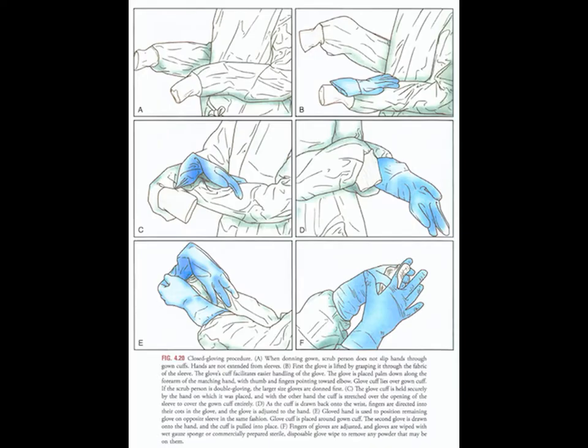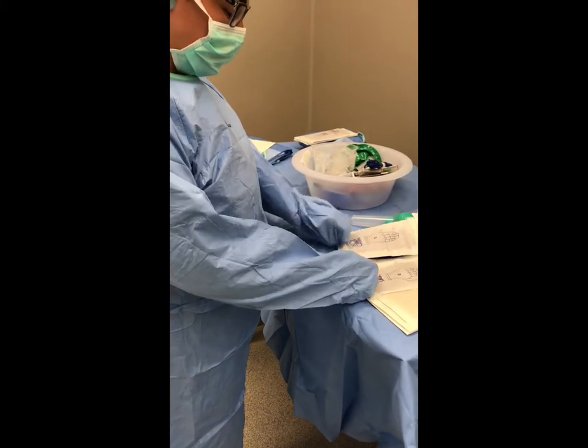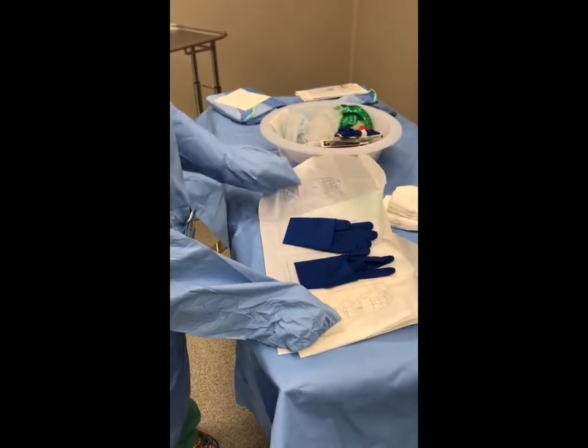The closed gloving procedure should be used when initially donning a sterile gown and gloves. The glove is placed palm down along the forearm of the matching hand, with the thumb and fingers pointing towards the elbow. The glove cuff is held securely by the hand on which it was placed, and with the other hand the cuff is stretched over the opening of the sleeve to cover the gown cuff entirely. As the cuff is drawn back onto the wrist, fingers are directed into the glove and the glove slides over the hand. The gloved hand is used to position the remaining glove on the opposite sleeve in the same fashion. Watch as the surgical technologist demonstrates the closed gloving procedure.